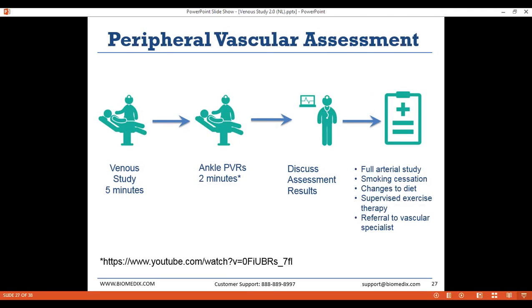The vascular assessment protocol works as follows: the patient comes in, you perform the venous study — it takes four or five minutes. Then you lie the patient down and perform a segment of the peripheral test with just waveforms on the patient's ankles. If either of those results is abnormal, you're indicated for the full PAD study. If you bring the doctor back in to discuss the results, you can bill for an office visit — something like 99213 — and discuss results, recommendations about smoking cessation, or whether the patient would benefit from diabetic shoes or diabetic compression stockings.